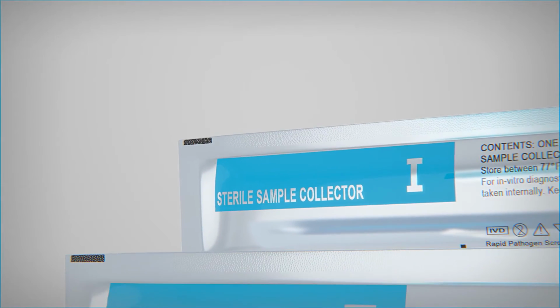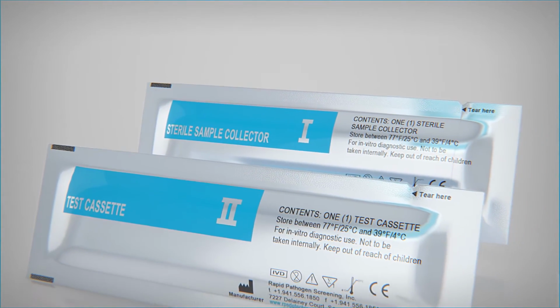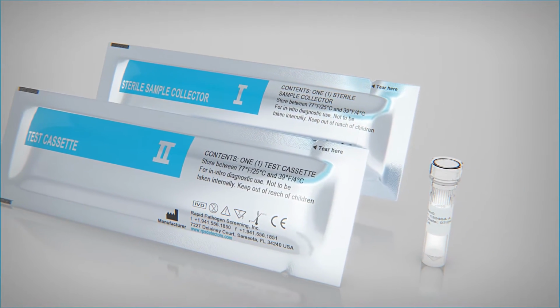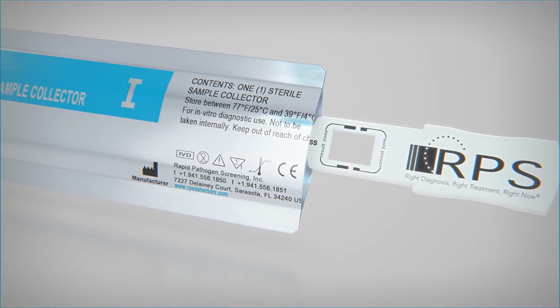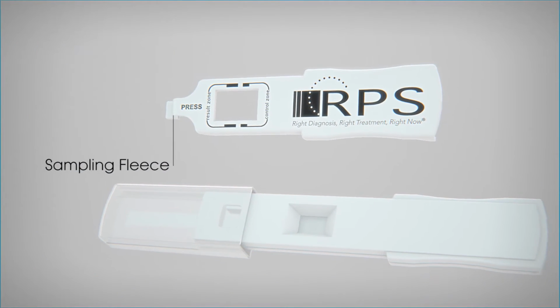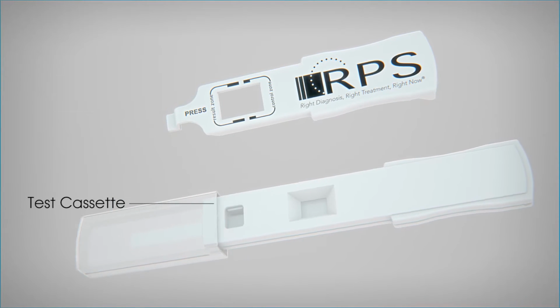The InflammaDry test includes 1 foil pouch containing a sterile sample collector, 1 foil pouch containing a test cassette, and 1 buffer vial. Tear open each foil pouch at the indicated perforation and remove the contents. Do not touch the sterile sampling fleece prior to collecting the patient sample. Once opened, the test cassette should be used within 1 hour.